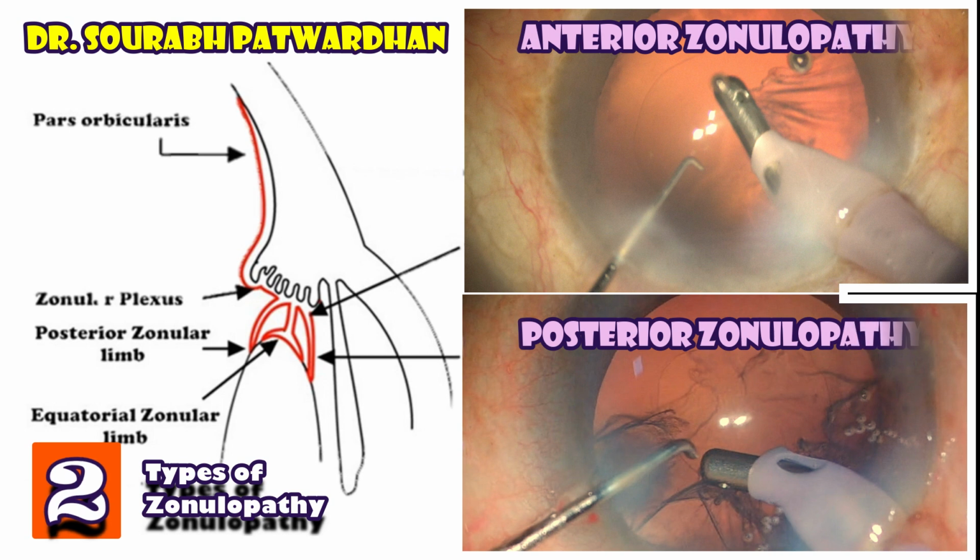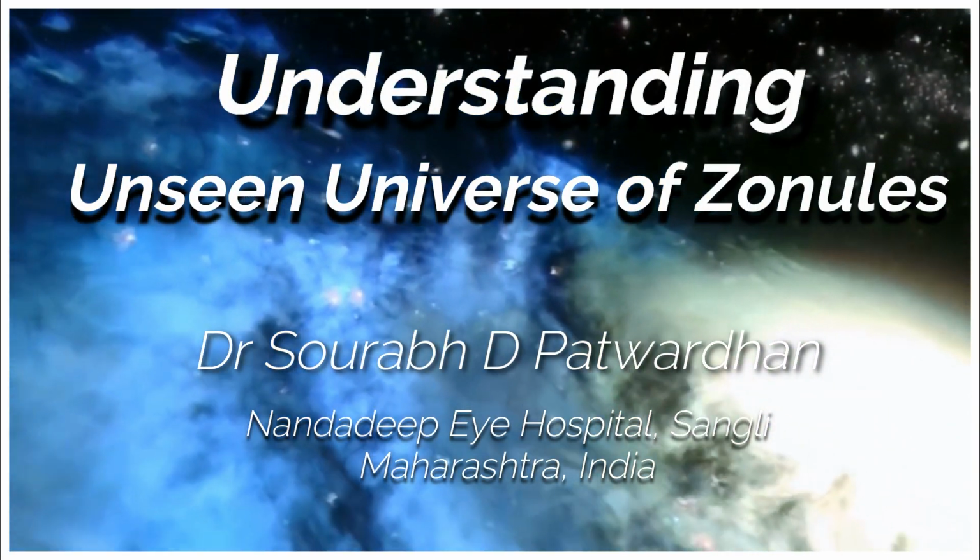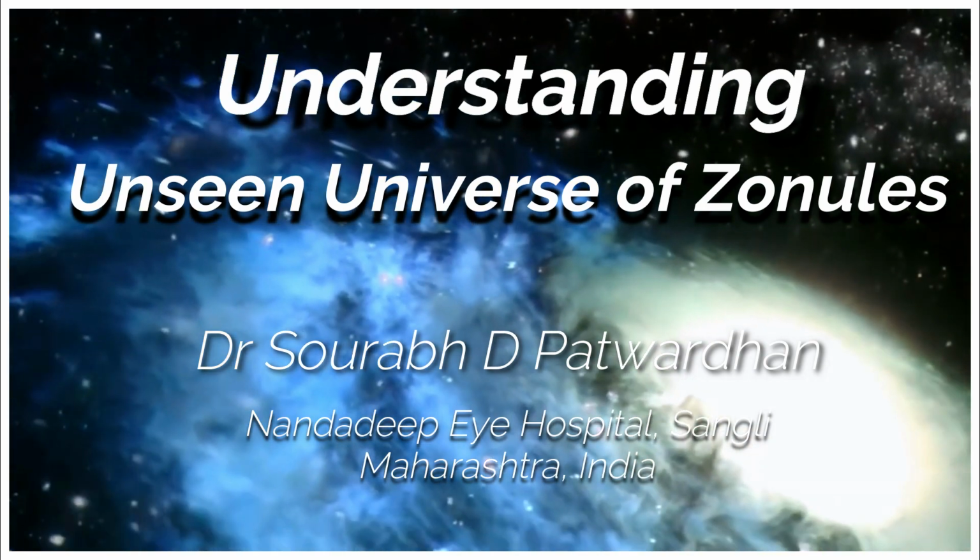So with this video, we would like to demonstrate the two types of zonulopathies, anterior zonulopathy and posterior zonulopathy. And hopefully we'll understand better about the unseen universe of zonules.